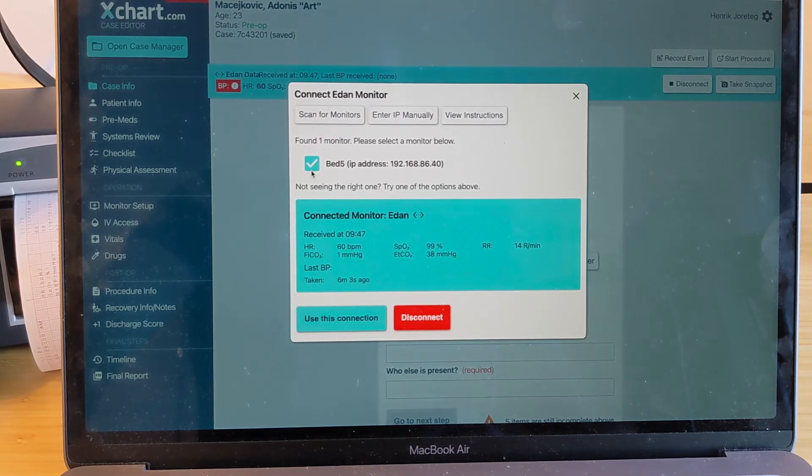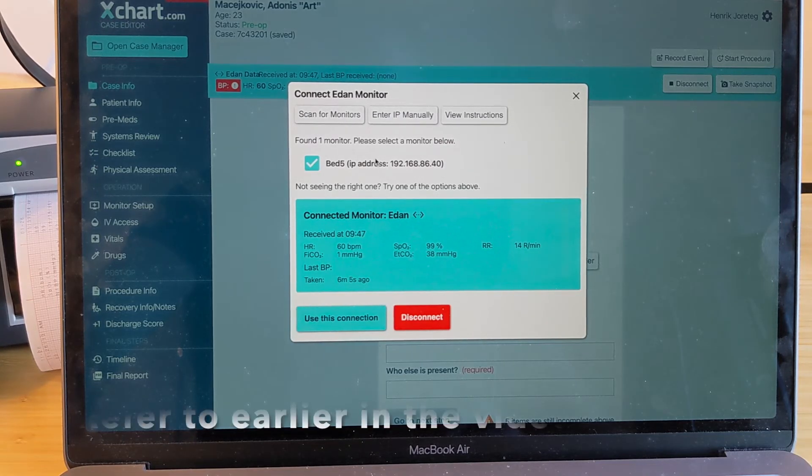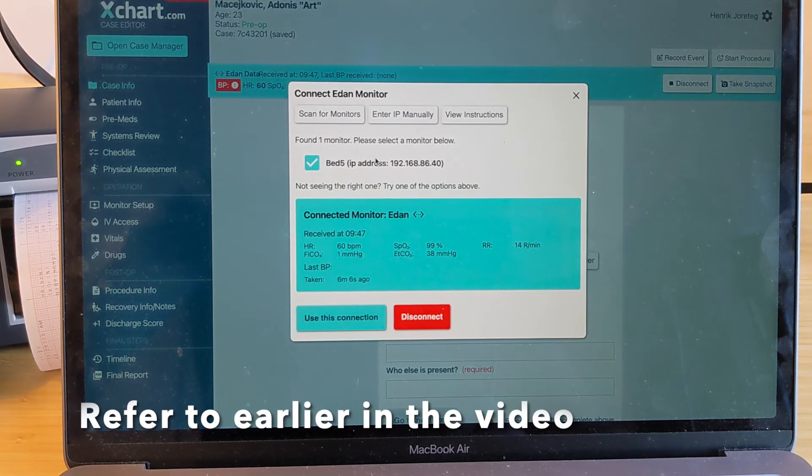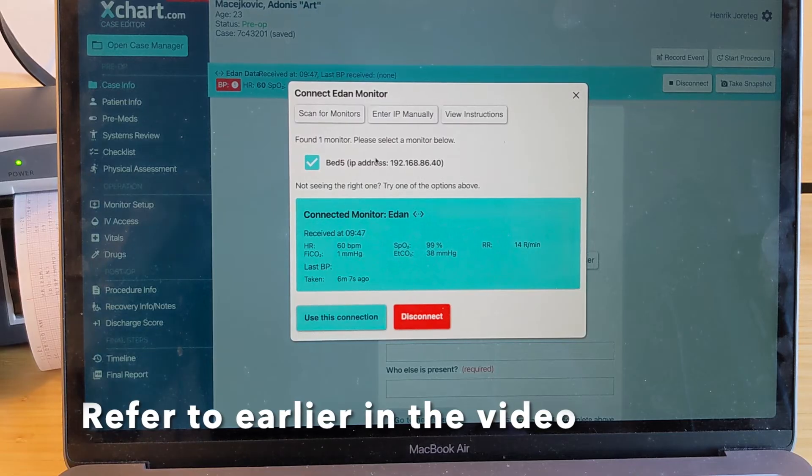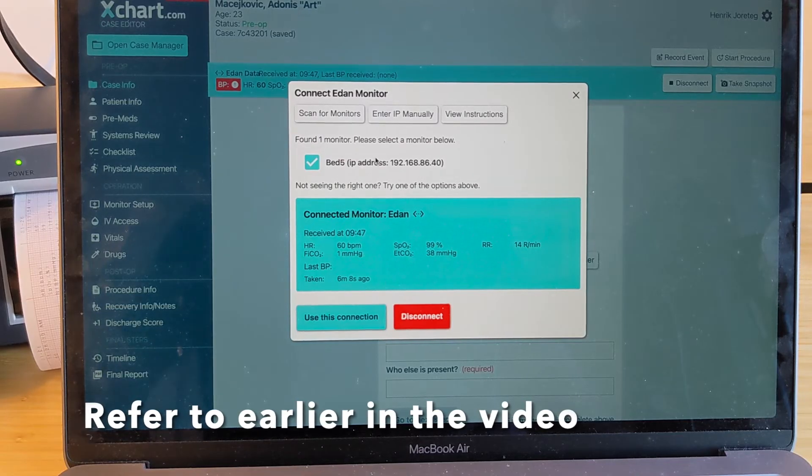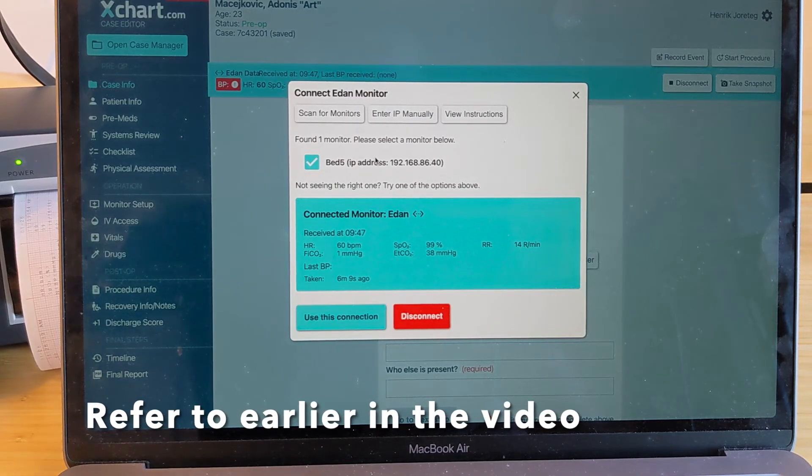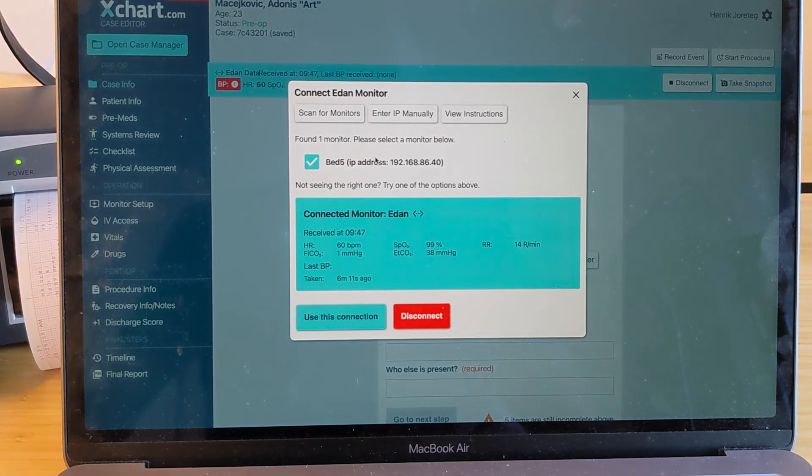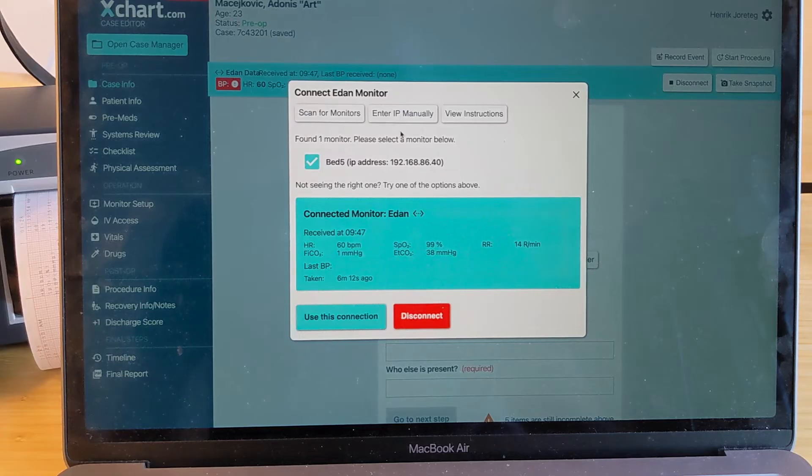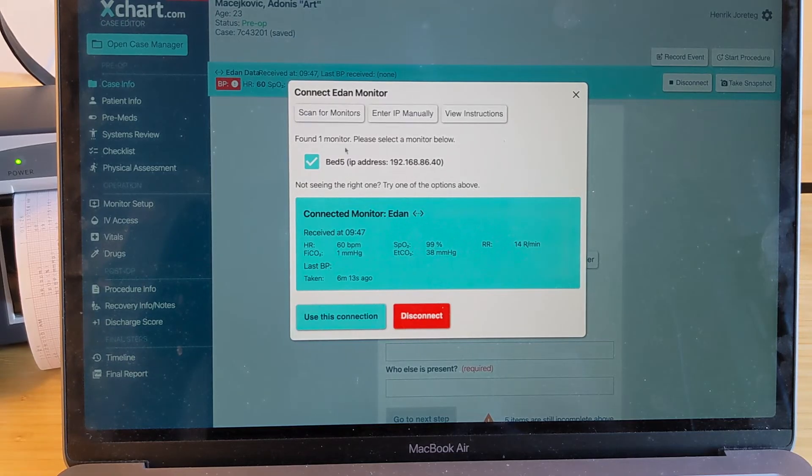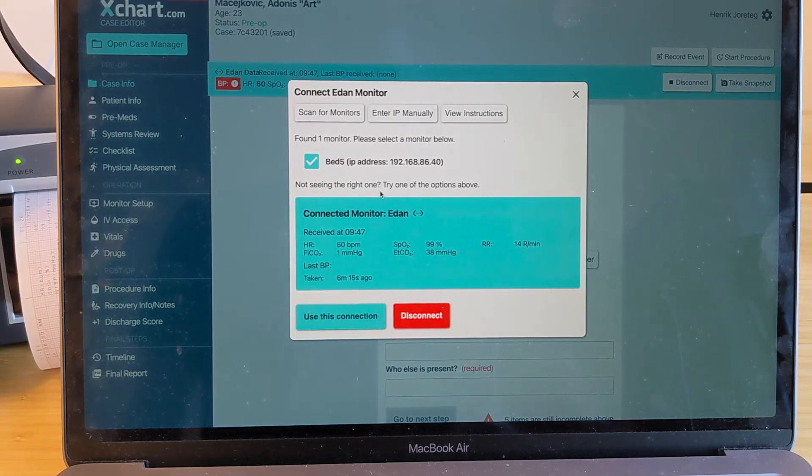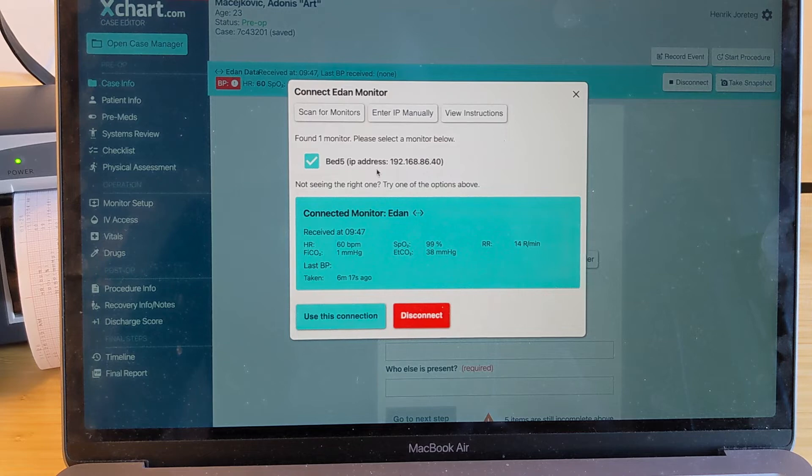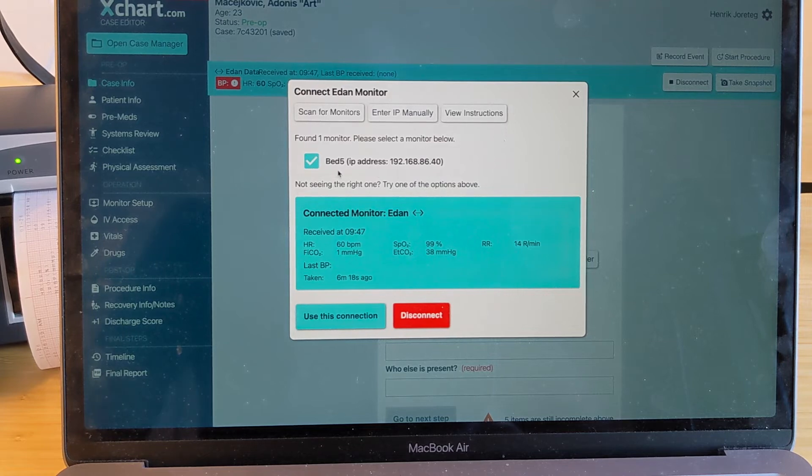So if you do that, then you'll want to refer to the video before about how to get the IP address of the monitor so that you know what to enter into that field. You can also hit scan again to rescan. And in this particular case, it only found one monitor.